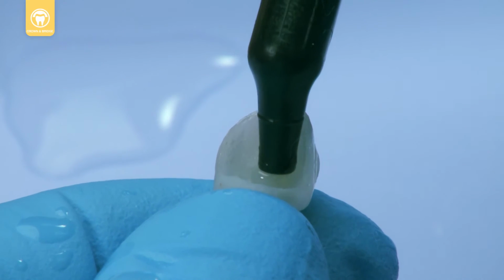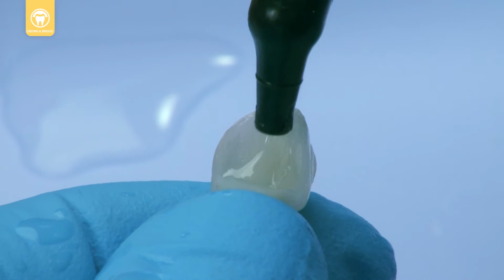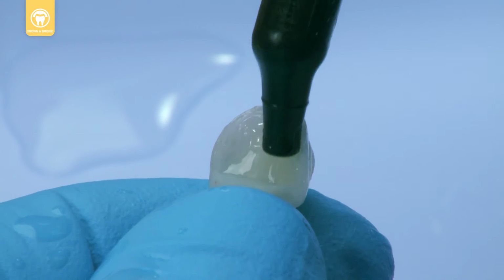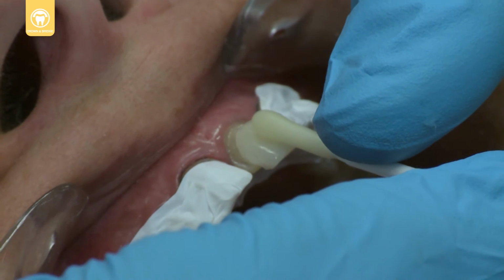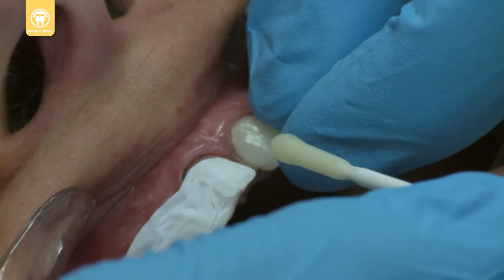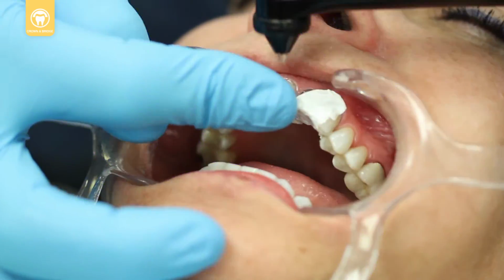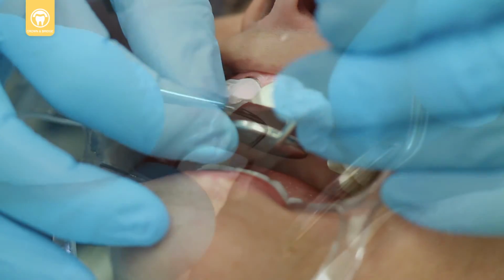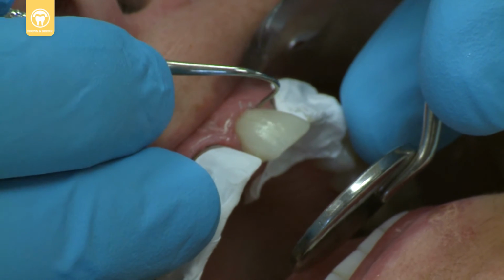Next, express a thin layer of PermaShade LC onto the inside bonding surface of the veneer. Carefully position and seat the veneer using gentle pressure. Tack cure the veneer with the Velo curing light for 2 seconds to avoid shifting. Clean the excess cement from the margins and place deox if desired.